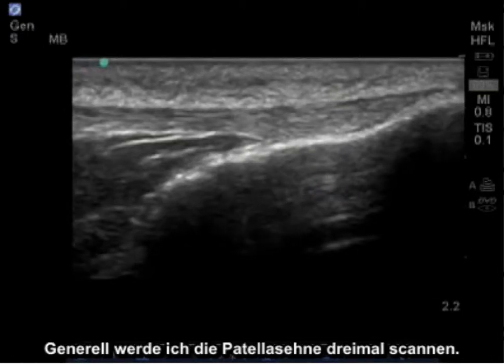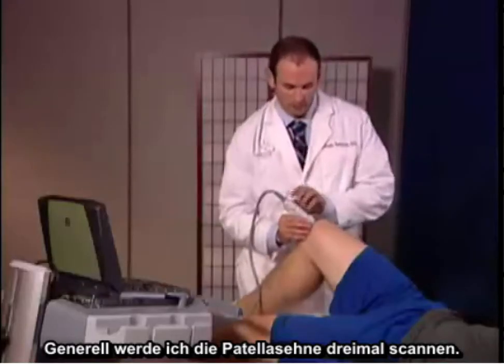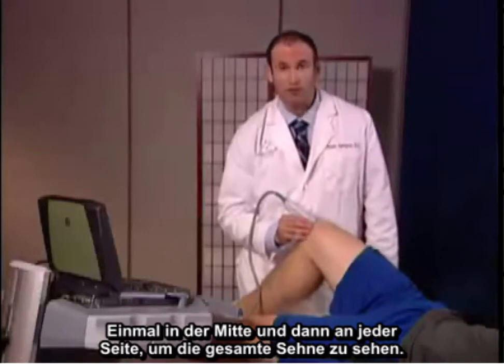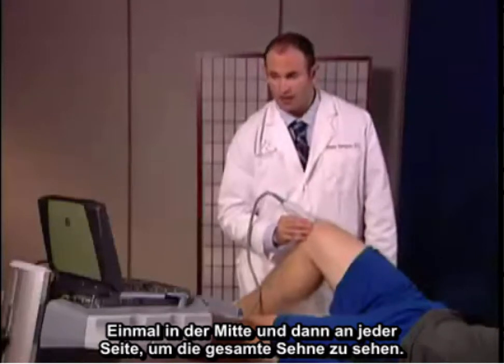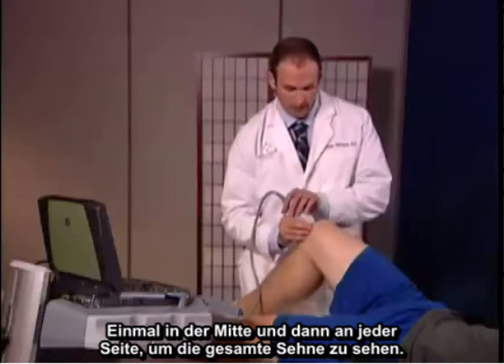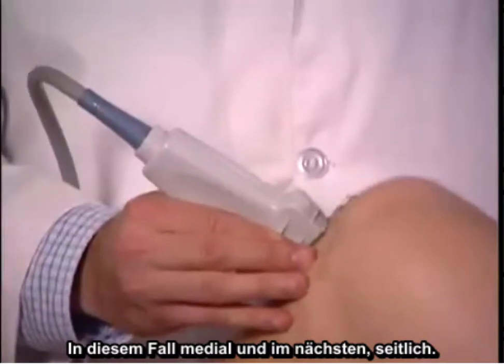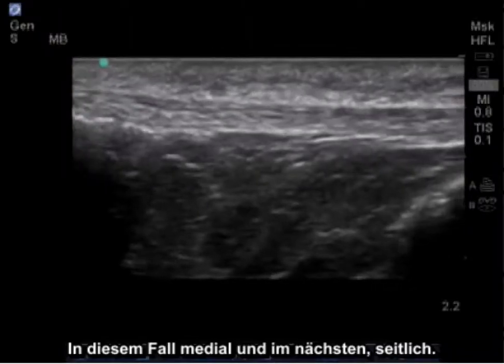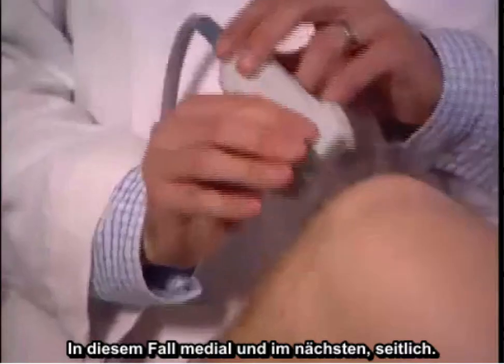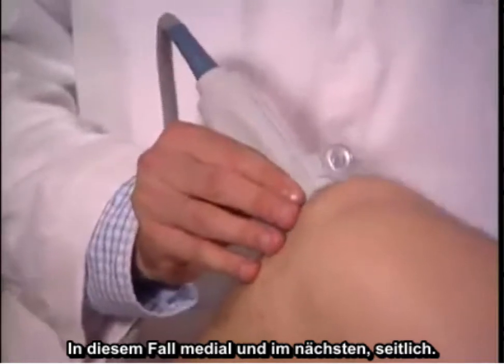Generally, I'll scan the patella tendon three times — once in the center and then once to each side to view the entire tendon. In this case, medially, and next laterally.